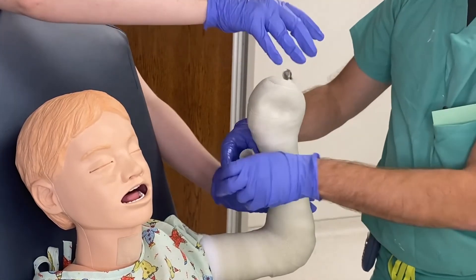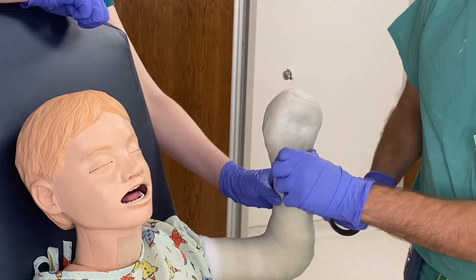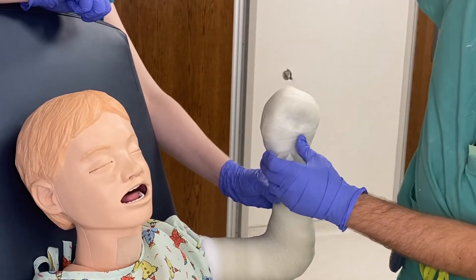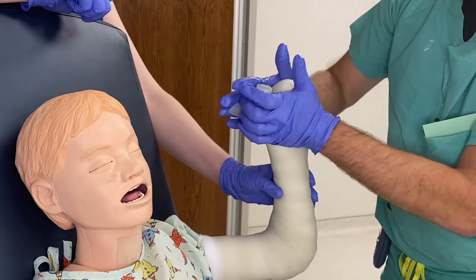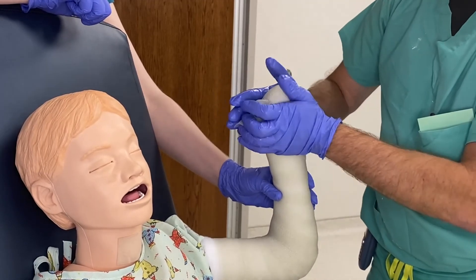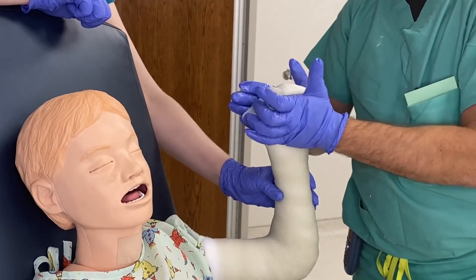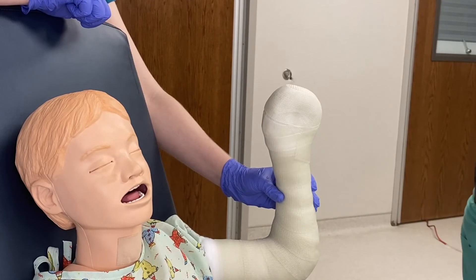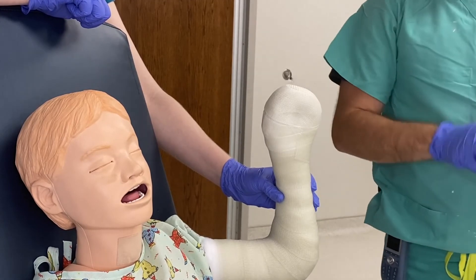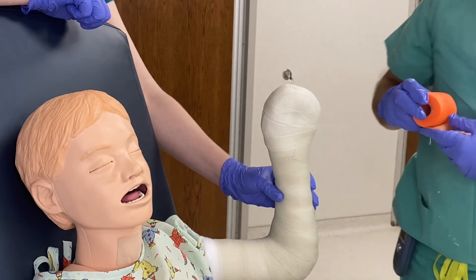You can do a single return layer if you don't need to mold it, and go ahead and use all of it. Up here you just want to rub it down, making sure it doesn't pop up, and mash the fingers nice and flat. You don't want your fingers curled up in the cast, so make sure when you're rolling — whether it's cotton or fiberglass — those fingers are flat and not overlapping each other.